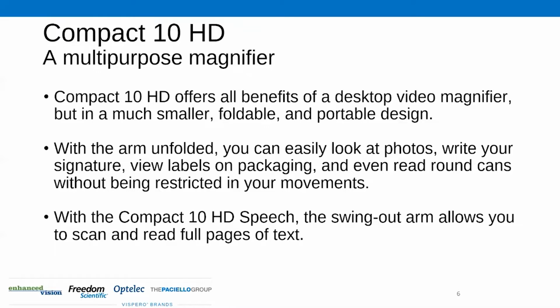And I think with portable handheld magnifiers, writing underneath them is always a struggle. And with that fold-out arm, it allows you to do that. So, like you said, if you're writing out a check, filling out a form, things like that, it really makes a big difference. That's right. Yeah.